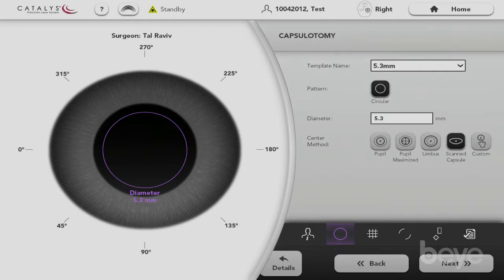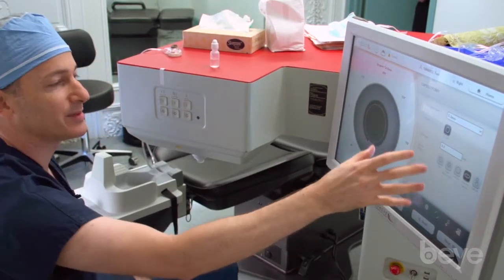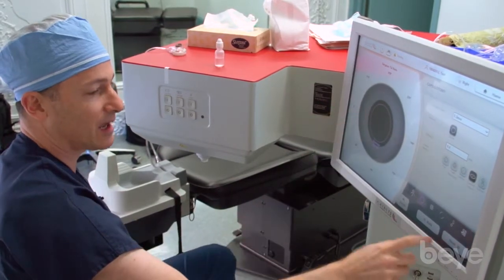For centration, I use what's called the scanned capsule method, using OCT imaging to help center the capsulotomy on the lens. This is a feature that can only be done with the laser and not manually. Manually we're just using the pupil, which may not be a good guide for the capsulotomy.